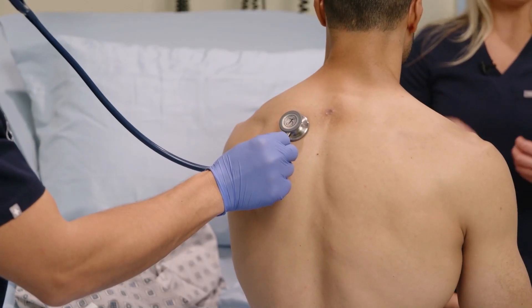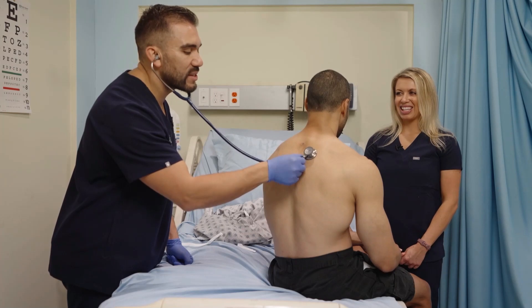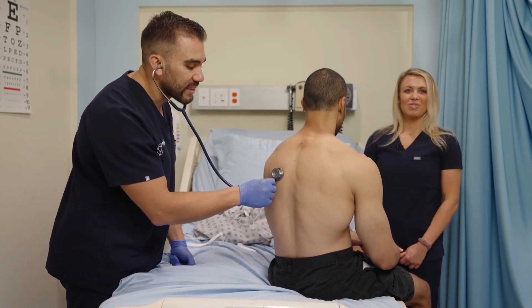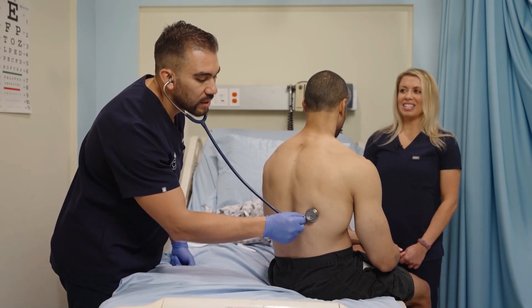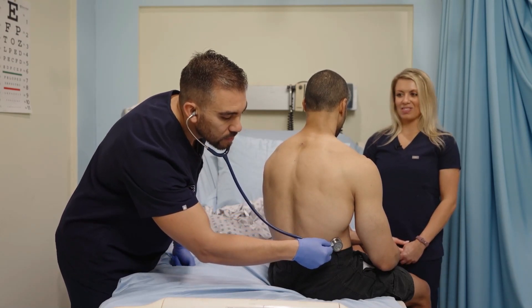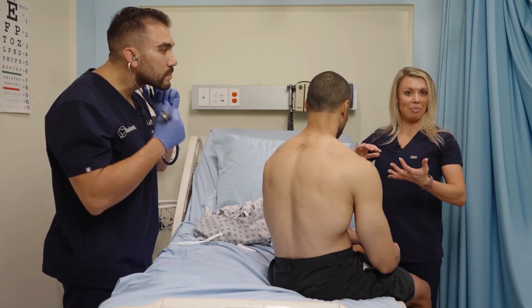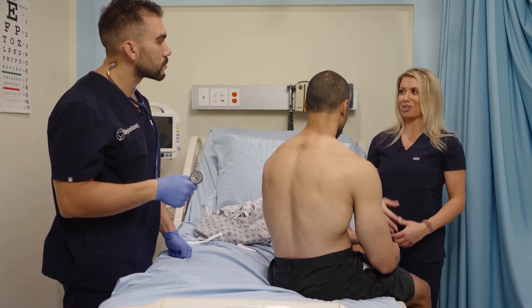We want to take our time and not hyperventilate our patient. You've been to the doctor's office where they put a cold stethoscope on you and say 'take a deep breath and relax' — we're going down and then across, listening to those upper, middle, and lower lobes of the lungs. Always make sure you're putting it on bare skin so you don't get extra sounds from the gown, and always auscultate on the front and back of the patient. You can better hear the lower lobes from the back and the upper lobes from the front — that gives you a more complete picture.